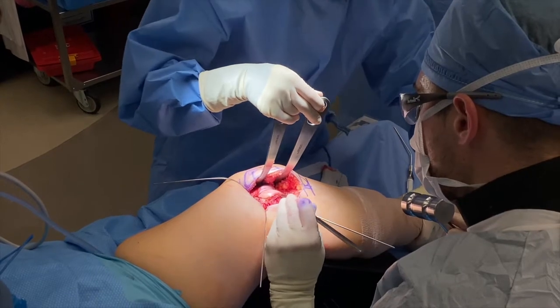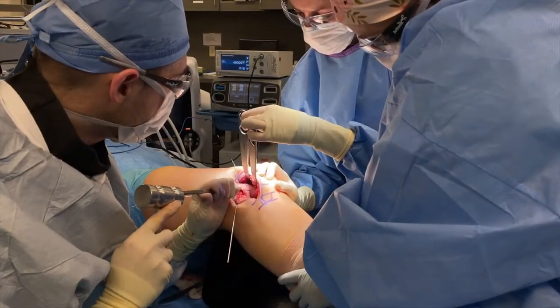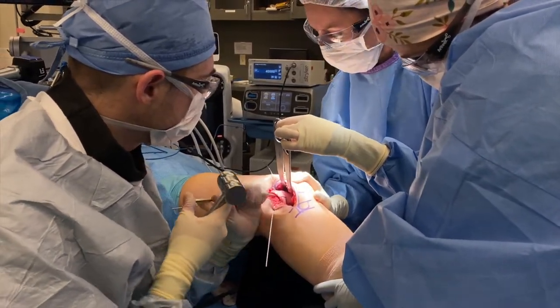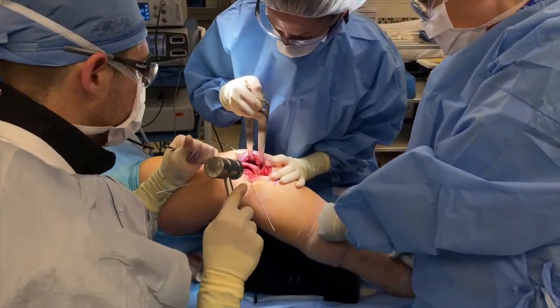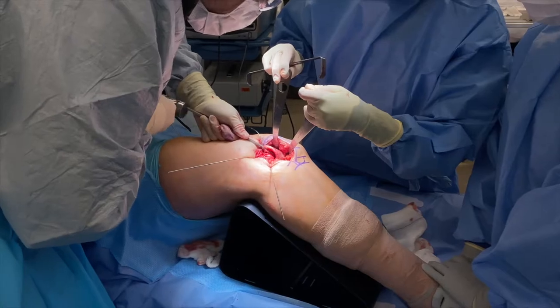Now I'm beginning to elevate all of the cartilage off the end of her femur using osteotomes, which are essentially like chisels. This is important because we need to resect some bone at the end of her femur to recreate that valley, so I need to elevate the cartilage to protect it and access that bone. This is a fairly tedious process because we certainly don't want to breach the cartilage.